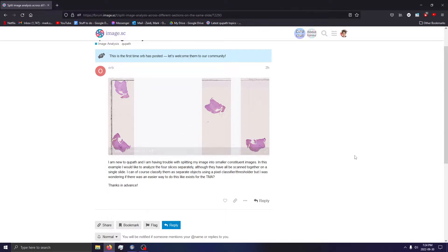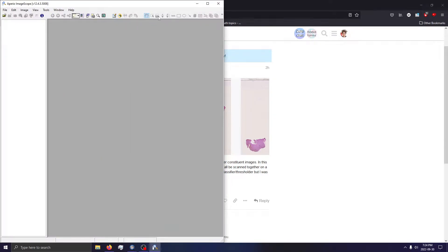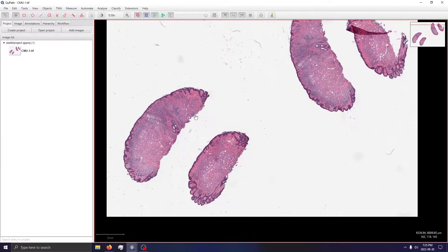What I've done in the past with images like these — if they were scanned with the Aperio scanner and they're in SVS format — is you can use something like ImageScope. With ImageScope, there's a tool called the Extract Region tool. You can draw and drag a square around the tissue section and export that as a separate SVS file, or if you want a non-proprietary format, you can export as JPEG, since both SVS and JPEG use JPEG 2000 compression. But since ImageScope is out of scope for this video, let's look at what can be done in QuPath and its limitations.